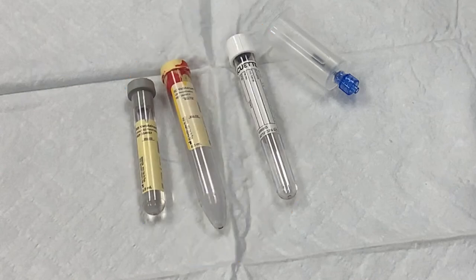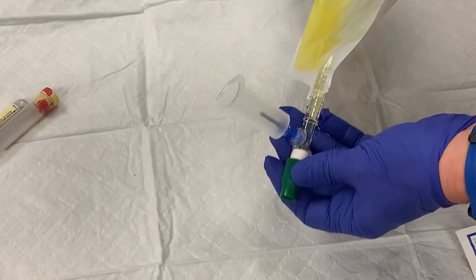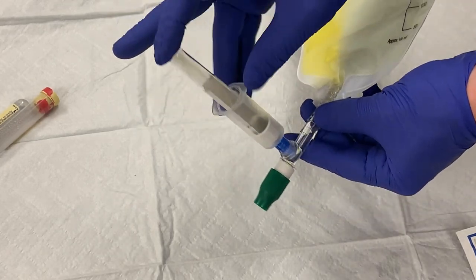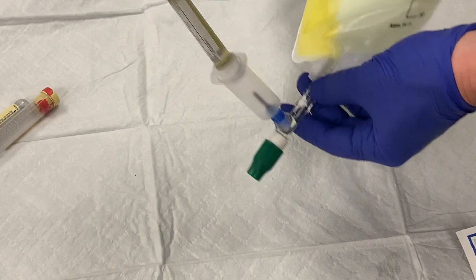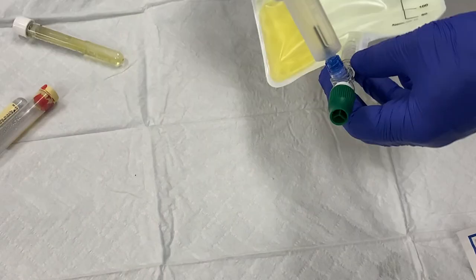Always fill the tubes in the same order: gray, then marble, then white. To fill the tube, first make sure the drainage bag is suspended with the spout facing down, so urine is draining toward the port. Then push the desired tube into the vacutainer adapter and push it down so that the needle in the adapter penetrates the tube. The vacuum in the tube will cause the urine in the bag to be pulled into the tube. When the urine stops filling the tube, remove it and fill the next tube. With your sample collected, you can now drain the remaining urine into the toilet by turning the green spout counterclockwise to open it, allowing the urine to drain, then flushing and disposing of the collection bag.